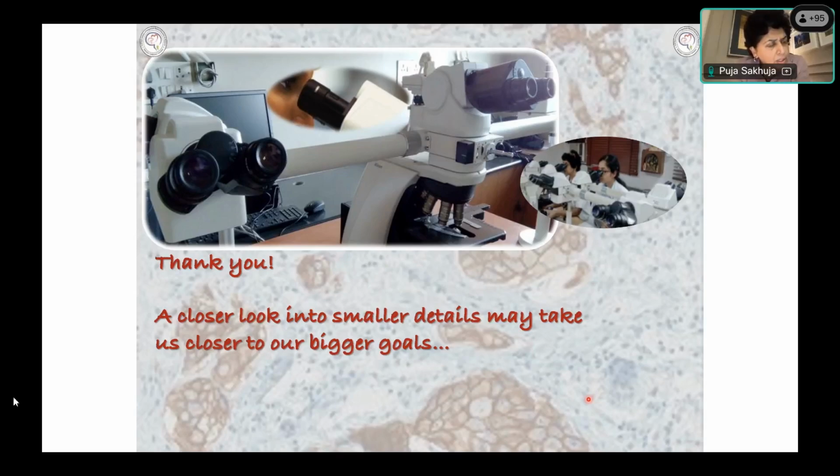There may be just some mild increase in lymphocytes and plasma cells in the lamina propria of the duodenum, where in any case there are a fair number of lymphocytes and plasma cells. Same with giardia. There may be some non-specific increase in IELs. There may be some mild villus blunting, but they may not. So these ones may or may not cause too much change. Cryptosporidium and giardia. Whereas H. pylori will usually cause active gastritis as well as lymphoid follicle formation.